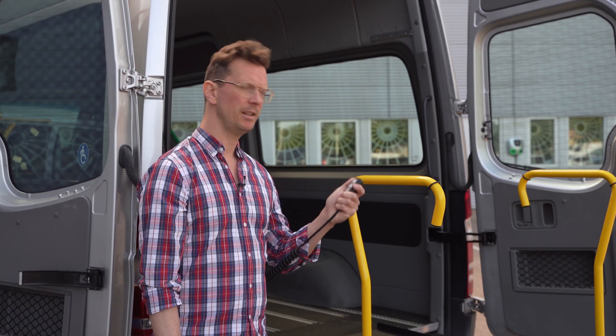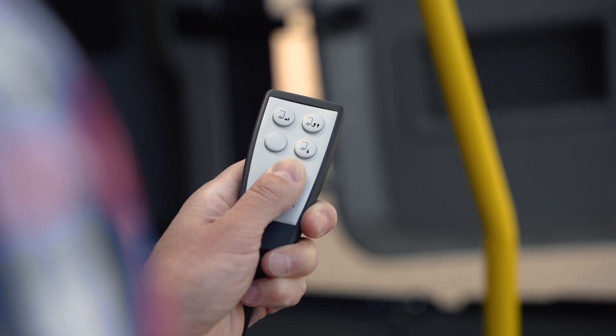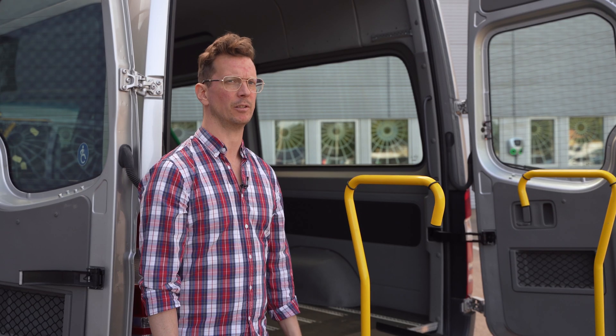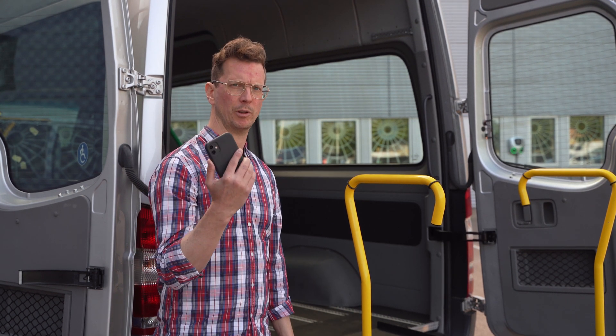For simplicity, only three buttons are used to control the lift and clear visuals indicate the function of each button. The A-Series is also compatible with the BraunAbility Remote app, which lets you use your smartphone to control the lift.